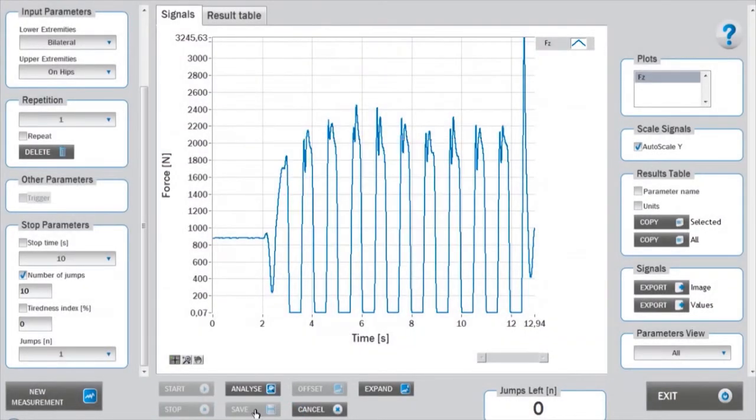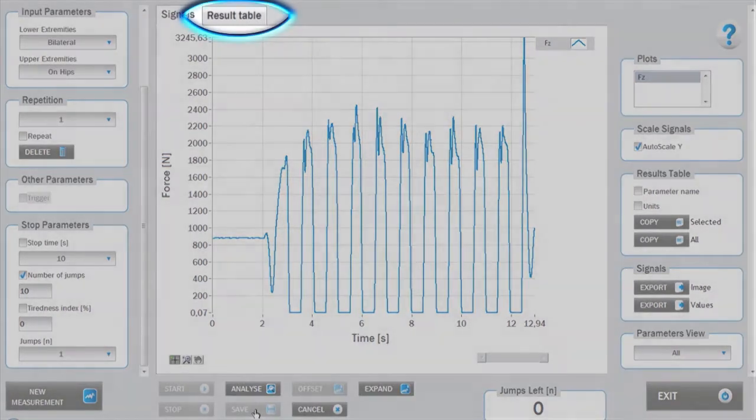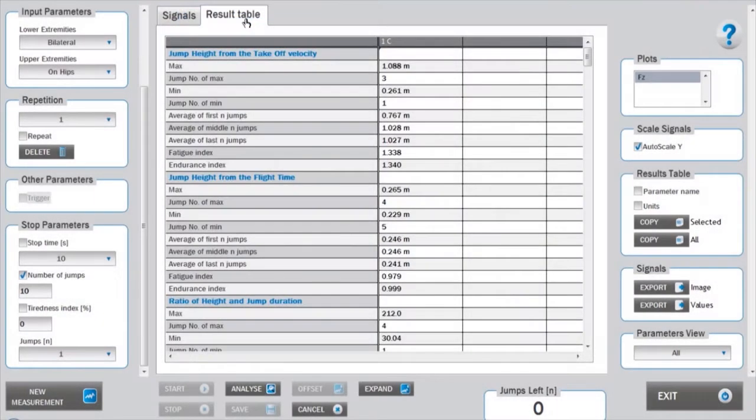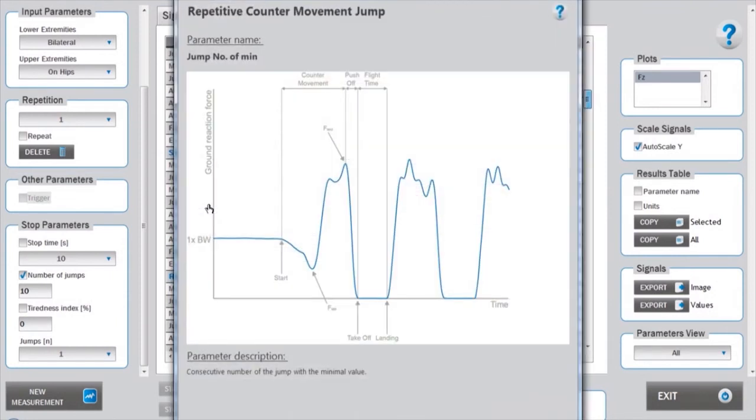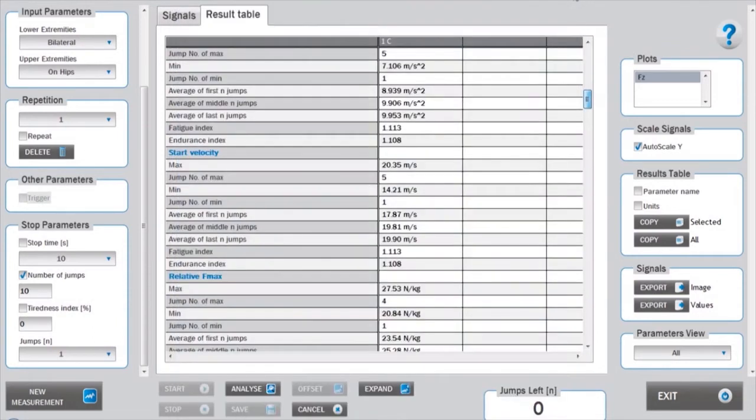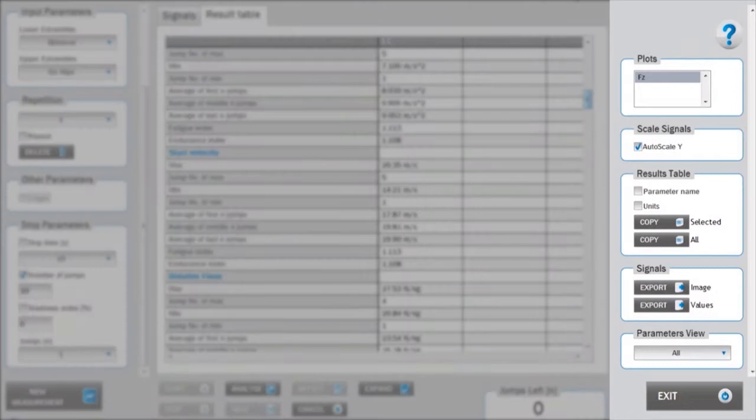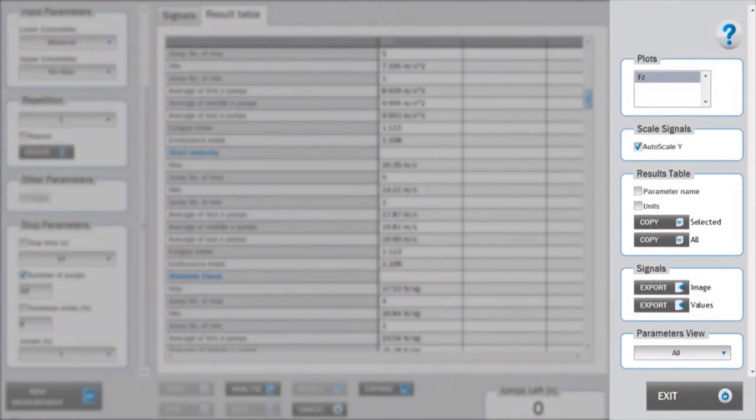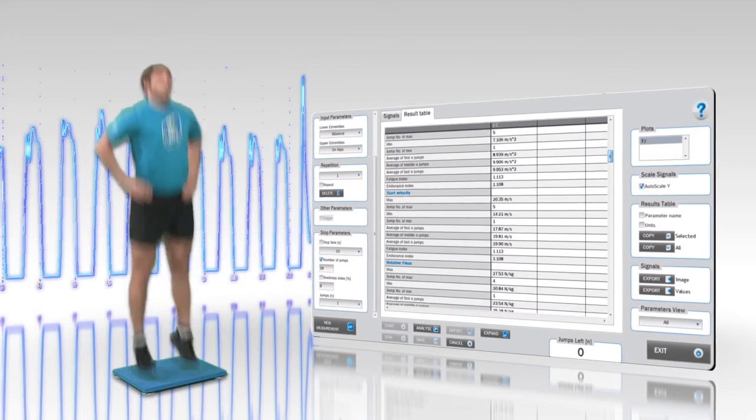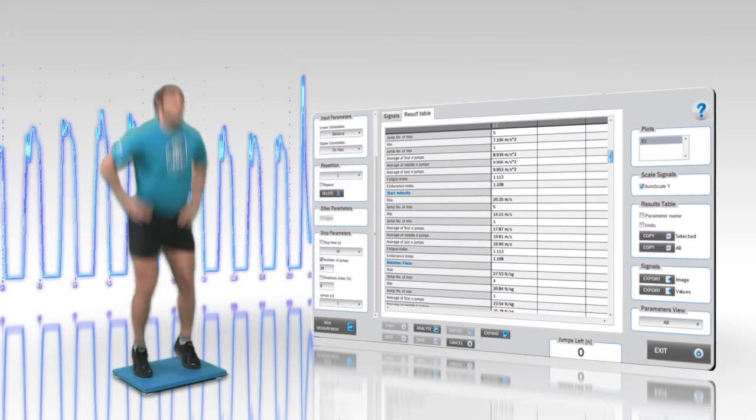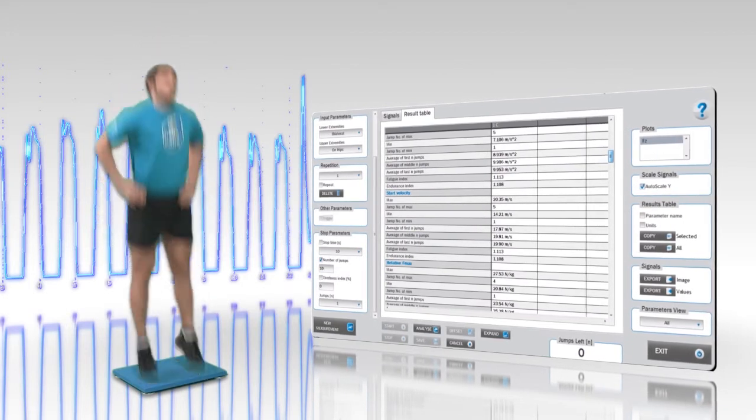The central window displays the ground reaction force measured by the force plate. Data from the analysis can be viewed under the results table tab. Each parameter calculated has nine values. A more thorough description of parameters can be accessed by right-clicking on the parameter's name. Options for displaying specific sets of parameters can be accessed in the parameters view menu in the right panel. For more information on that topic, please refer to tutorial number seven.